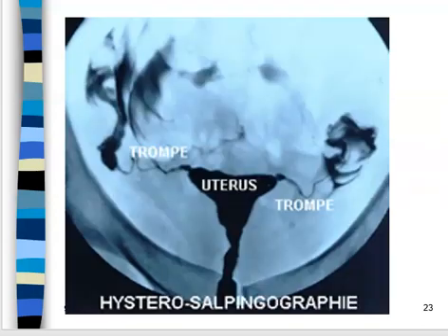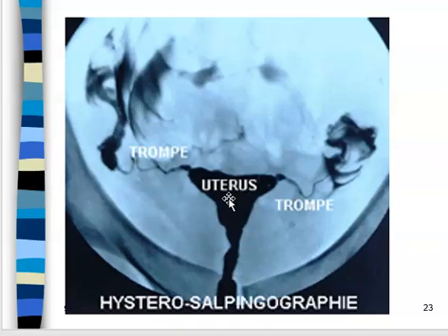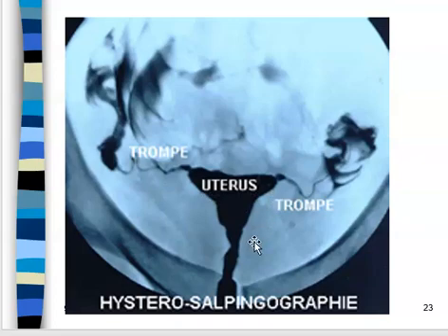Here's an image from France. The doctor has injected contrast into the uterus — it's nice and dark — and we see the uterine tubes, with spillage bilaterally into the peritoneal cavity. Perfect — that's what this is supposed to look like.